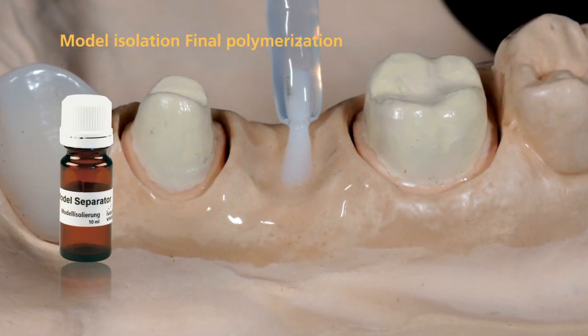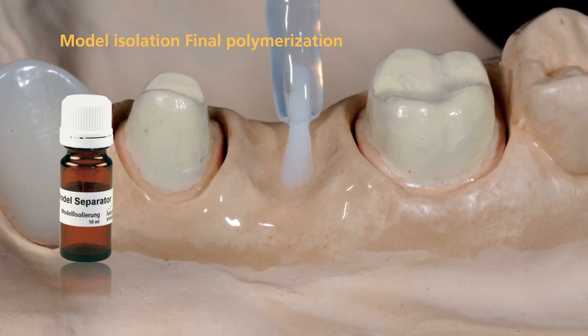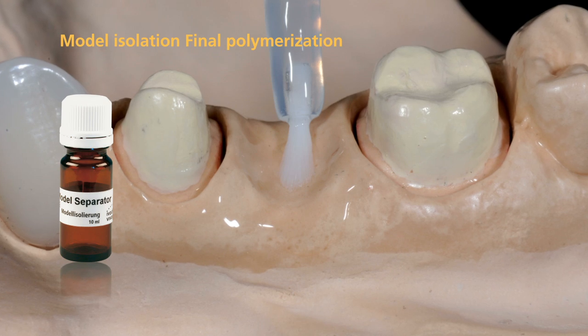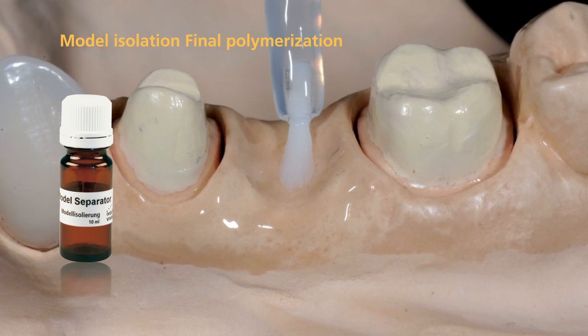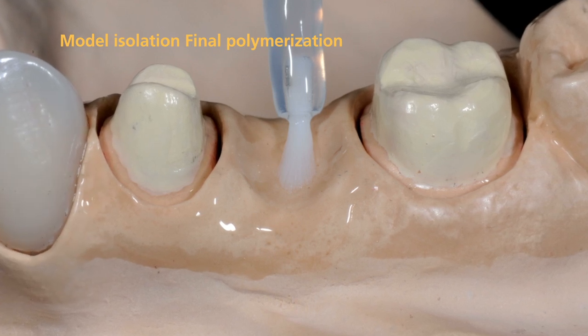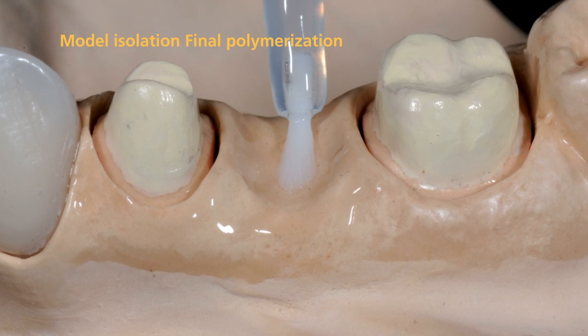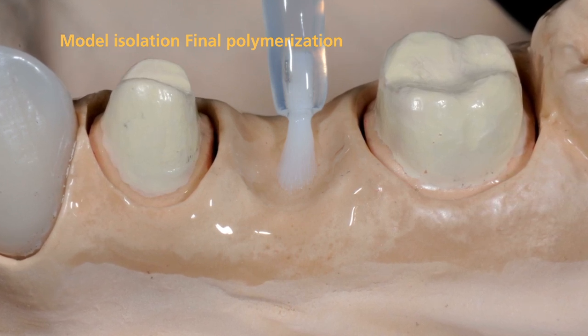Isolate all areas of the model which may come into contact with SR-NEXCO before you begin the dentin and incisal layering procedure. Use SR model separator to seal these areas. Apply the material in a thin coating, allow it to react for a short time, and remove excess with oil-free compressed air.